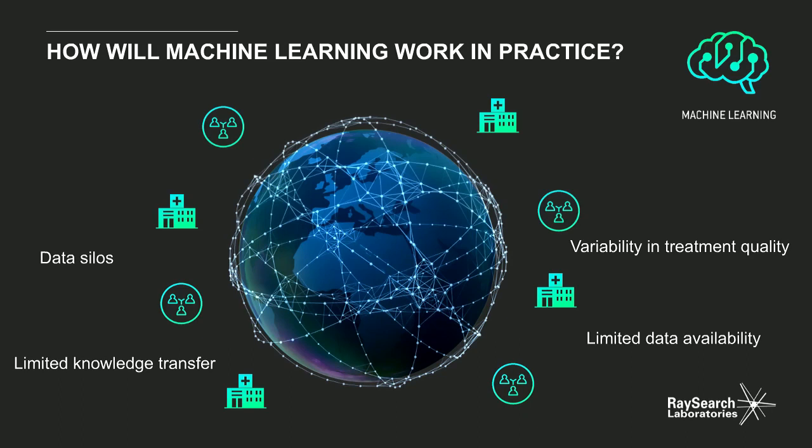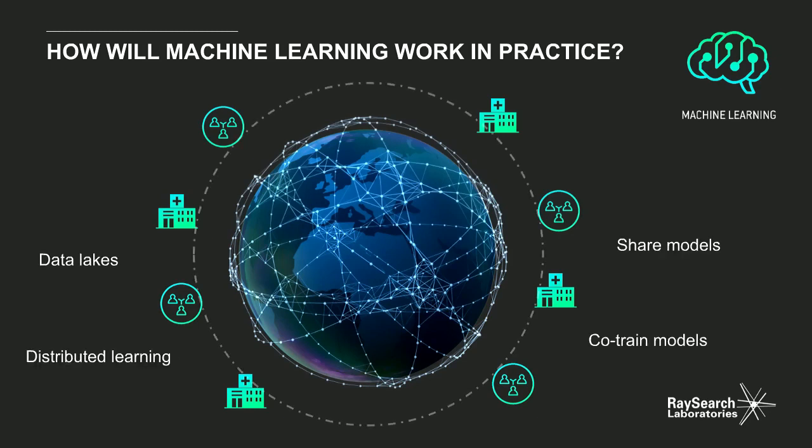What I think would be fantastic is to see this instead, where we have data lakes and clinics sharing models, maybe even co-training machine learning models. As a vendor, we need to support technology that is arising, such as distributed learning, where the machine learning models are moved, but the data is not moved.